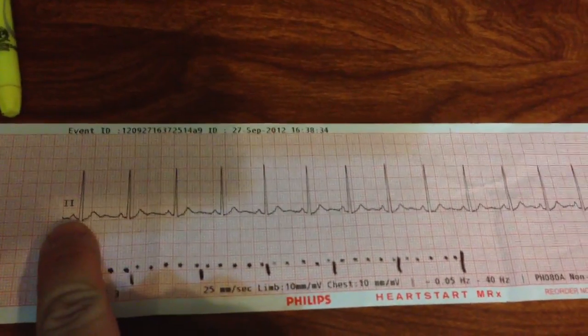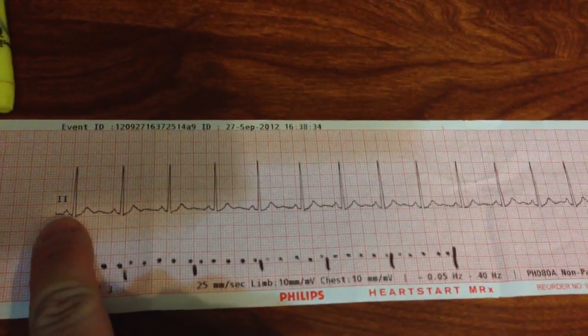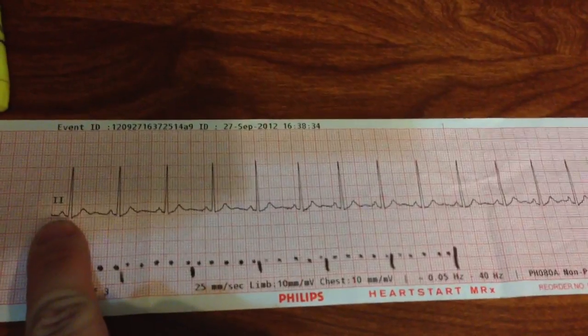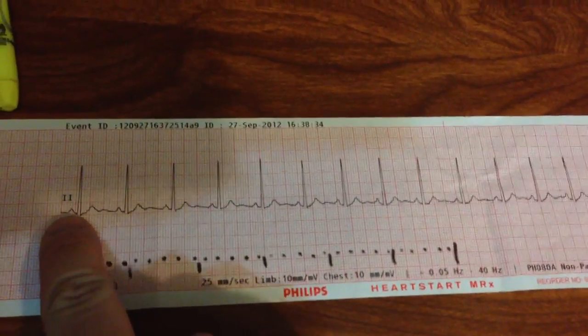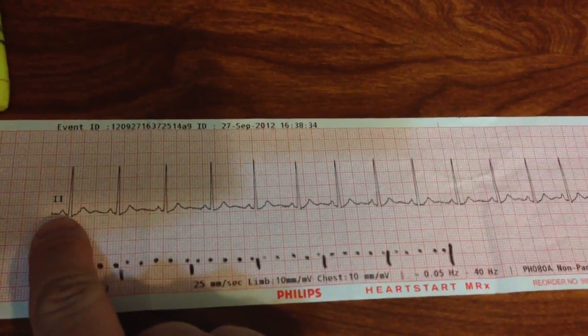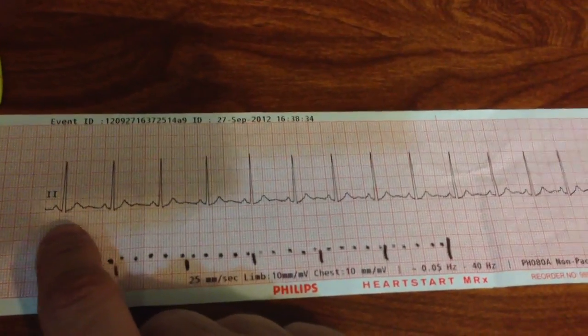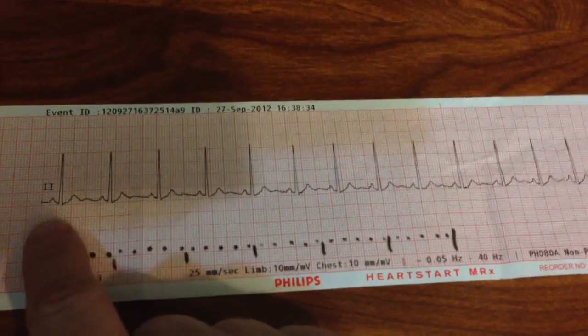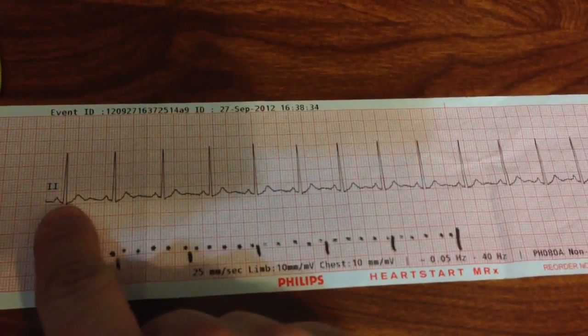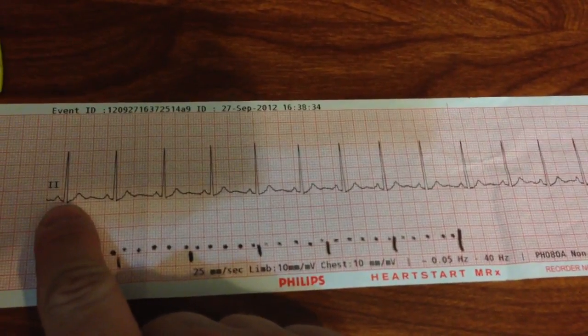Generally you'll monitor in lead 2. Lead 2 is a decent lead for looking at P-waves, and that's nice because one of the questions you always ask is: is there a P for every QRS complex?